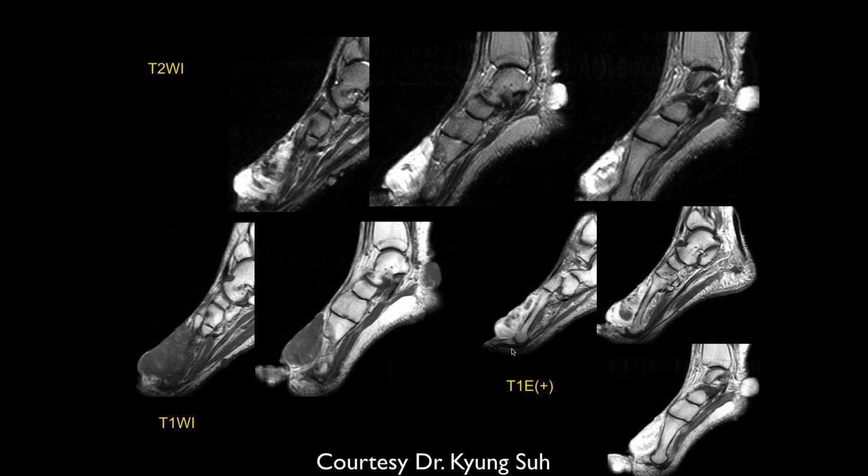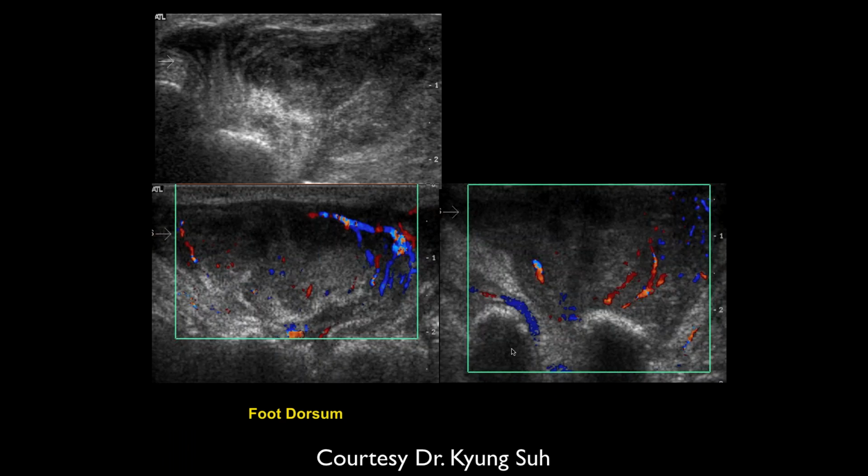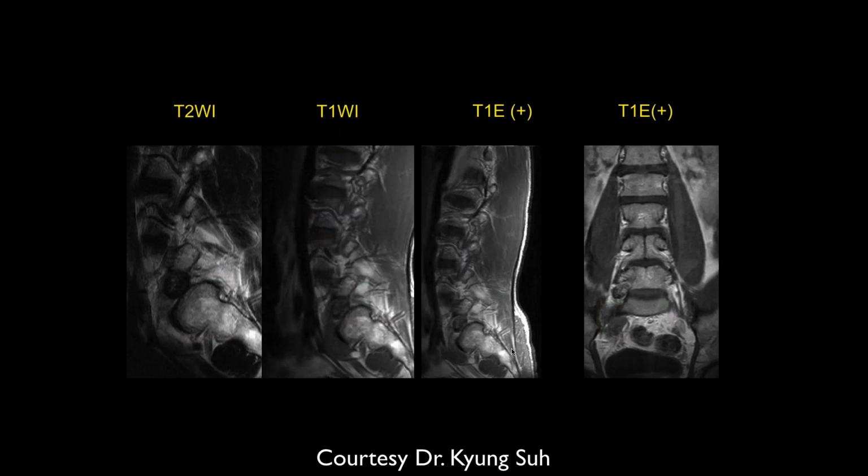Okay, so on these sagittal images, it looks like a very hypervascular mass with areas of necrosis centrally. The good thing is that the adjacent bone has no erosion or destruction, but there is vascularity. These ultrasound images show a lot of peripheral, but also central vascularity. So it's a very vascular lesion, probably either a plexiform neurofibroma or another large one. This patient maybe has neurofibromatosis.